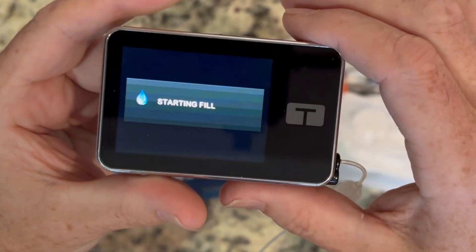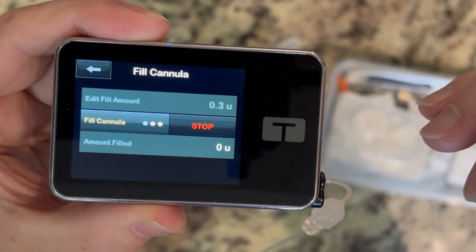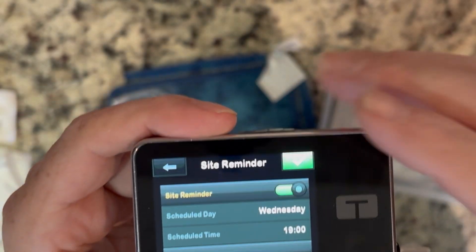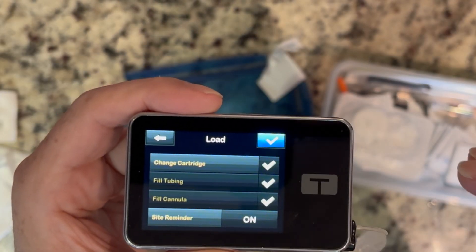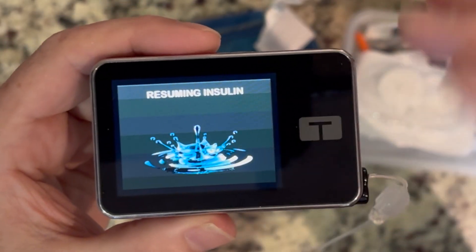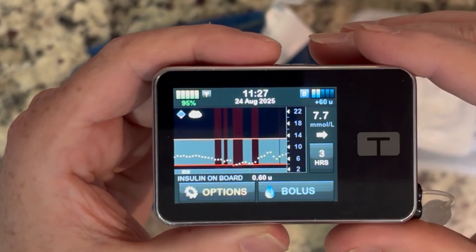Make sure you set your site reminder to a time of day that works for you. I had mine set for 7 a.m. — great for weekdays, but annoying on a Saturday when it wakes you up. So my site reminder is now set for 7 p.m. Then hit Resume Insulin. You can't really mess that up; it'll walk you through the steps. And you can see my sugar is now 7.7.